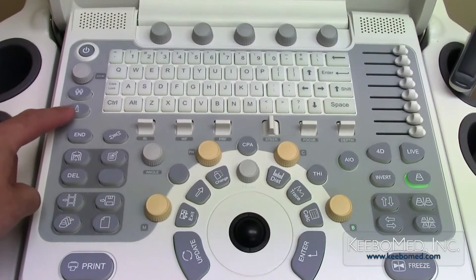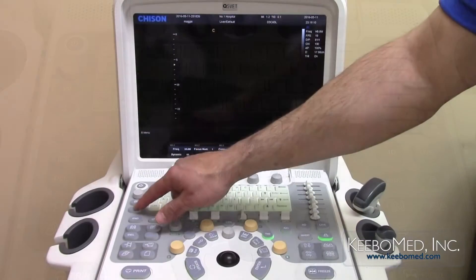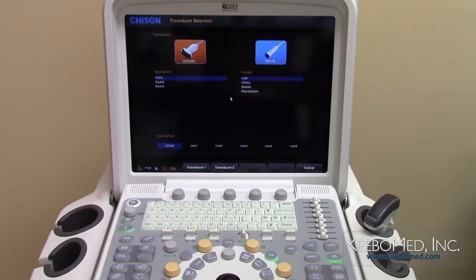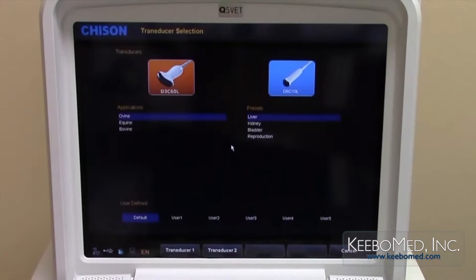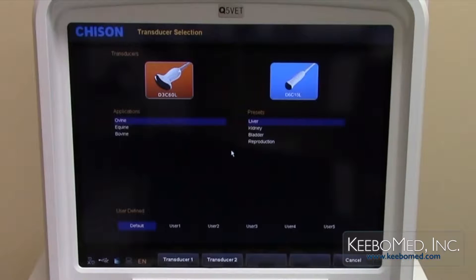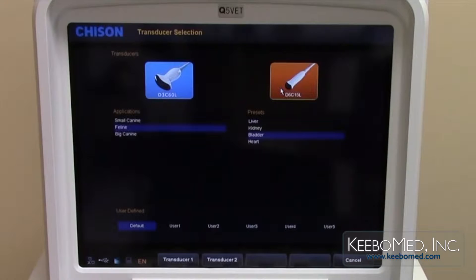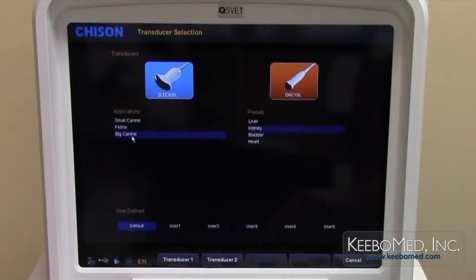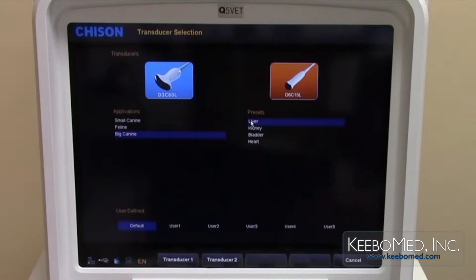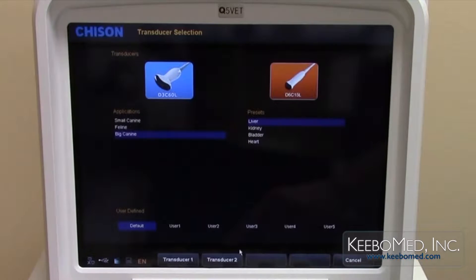Press the probe selection key to choose the correct probe, application, and preset for the examination. First, select the probe to be used — it will now be highlighted. Then select the correct application and examination. Finally, select transducer number 2 to begin the exam.